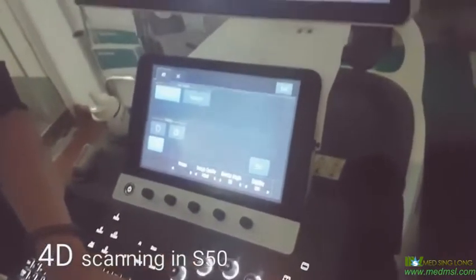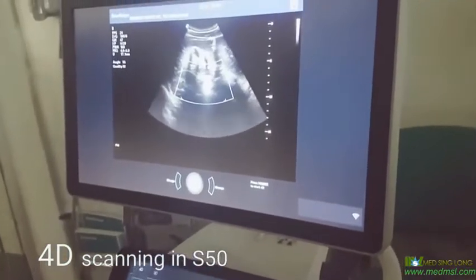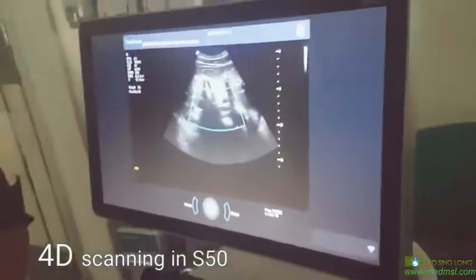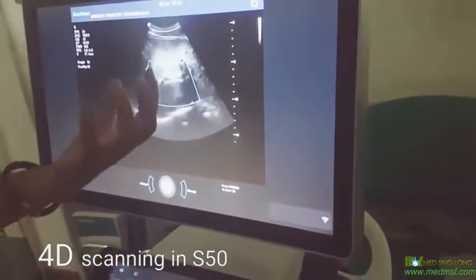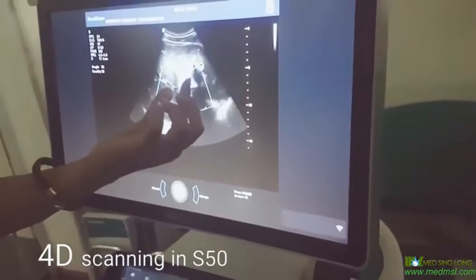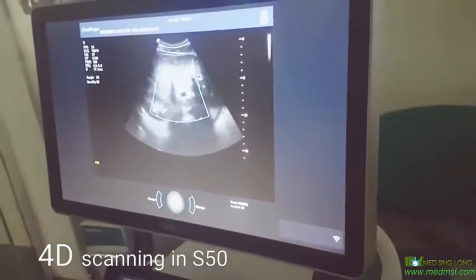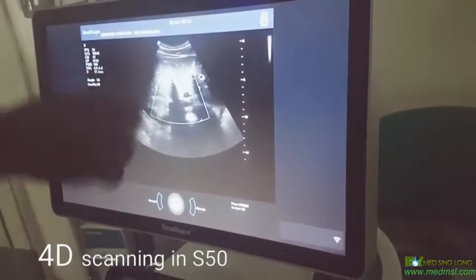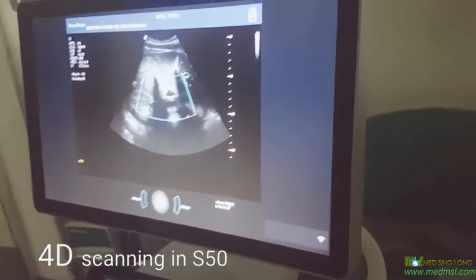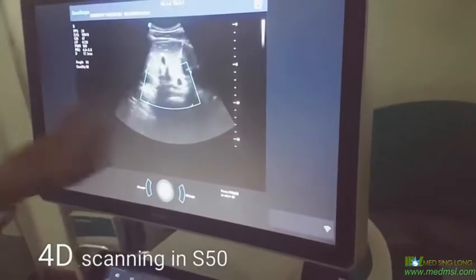So here we can set the region — what are the two boxes for? This box and this corner? The software will only render the area inside the box as a 3D or 4D model. So the baby should be immersed in the amniotic fluid within this region? It depends which part the doctor wants to see. Maybe the doctor only wants to see the face — you just put the face inside the box.